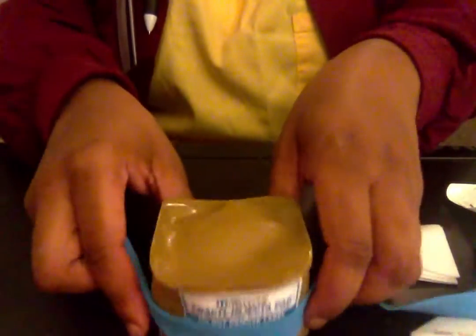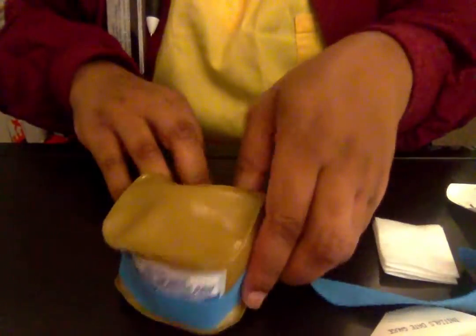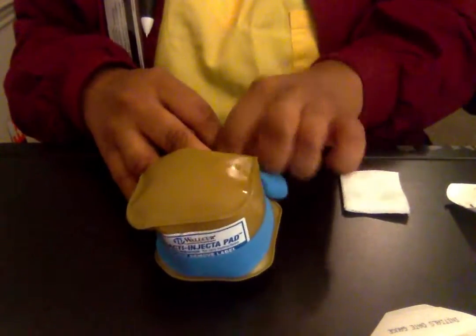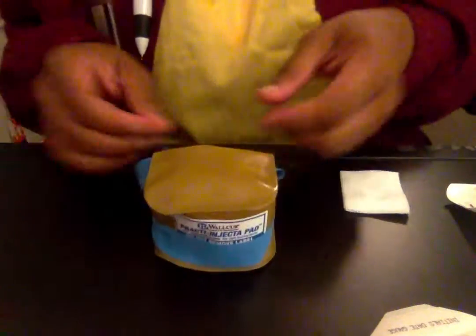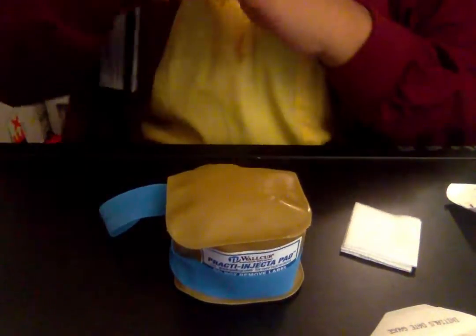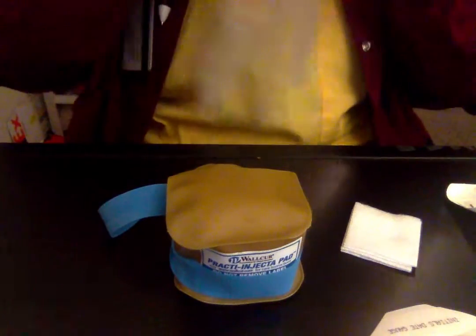So, as you can see, it's dry now. So, I'm going to reapply my tourniquet. So, now that I've got that tourniquet on and my surface is clean, I'm going to then put on my gloves.